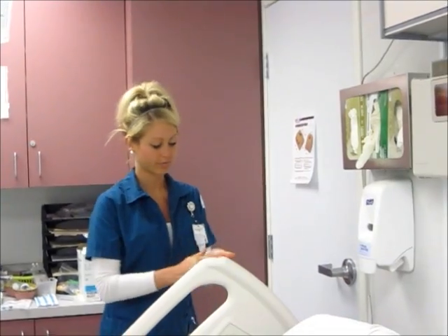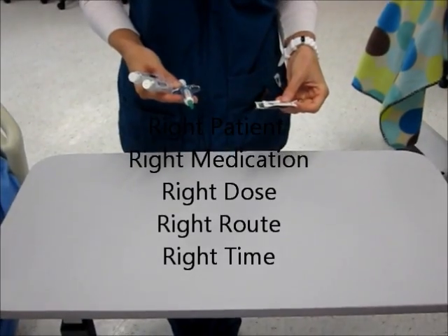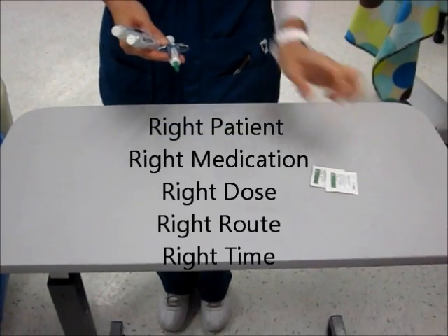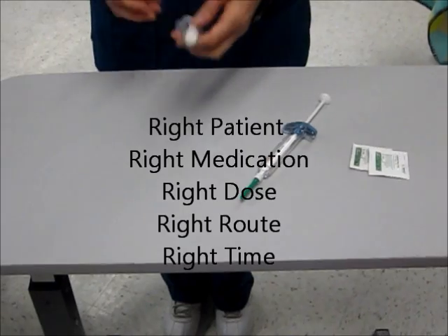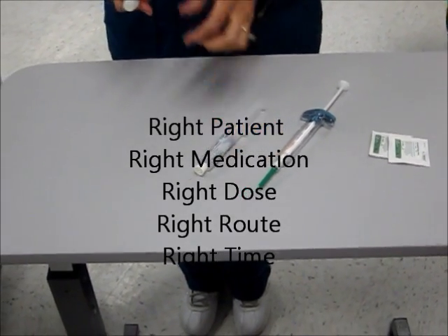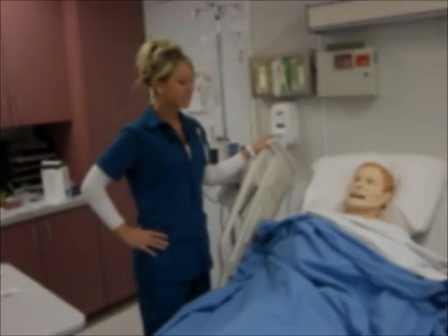Once it has been determined that the medication is all right to be administered, the nurse will perform hand hygiene. As the medication is being prepared, the 5 rights to medication administration will be verified. These include right patient, right medication, right dose, right route, and the right time administered.